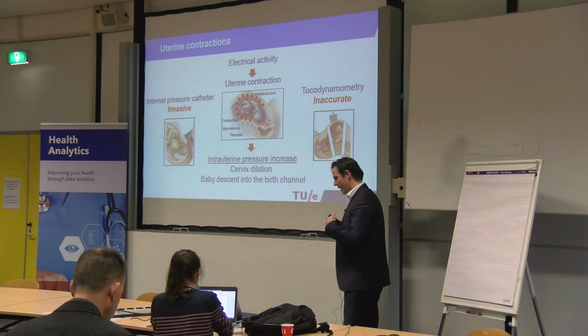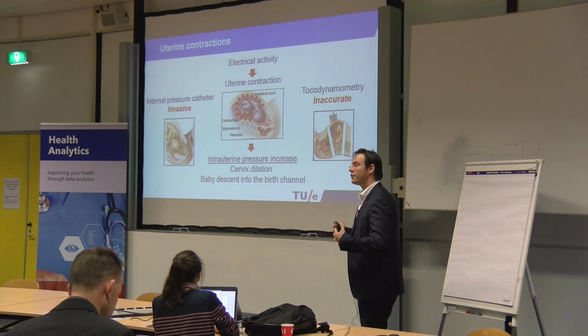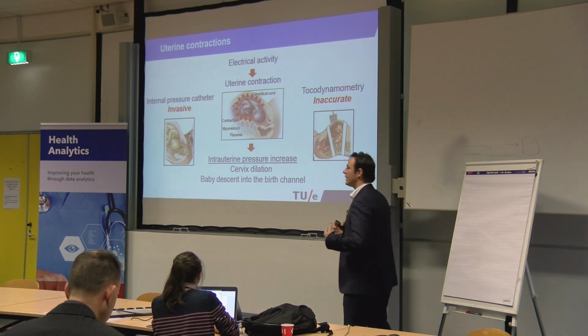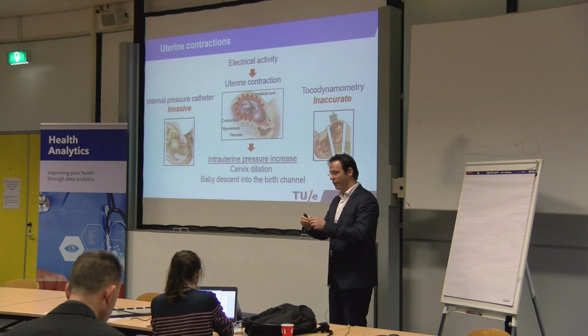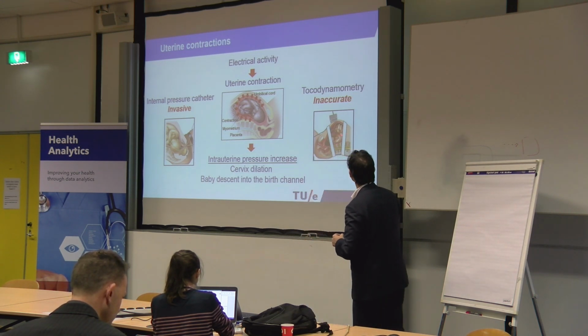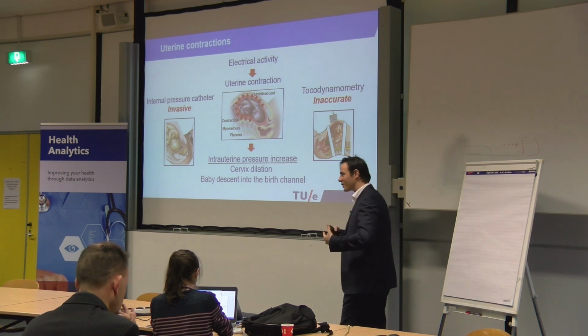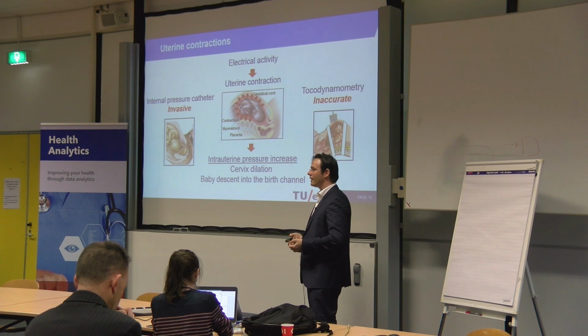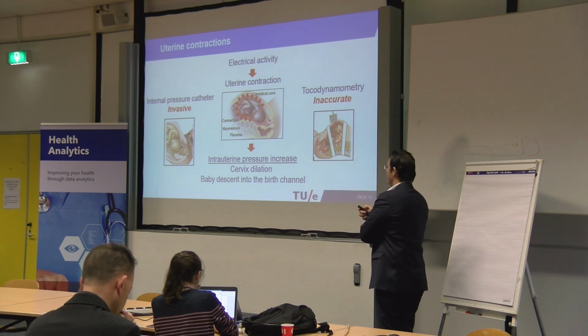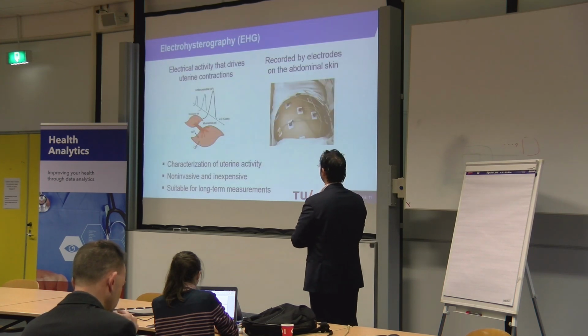That means, from the surface, you sense contraction of the belly by just using a strain gauge, so that will sense stretching of the skin on the surface. You can imagine this is rather inaccurate because any abdominal contraction will also contribute to that. But it can still be used, for instance, to look at the frequency of the contraction. Amplitude is quite difficult.